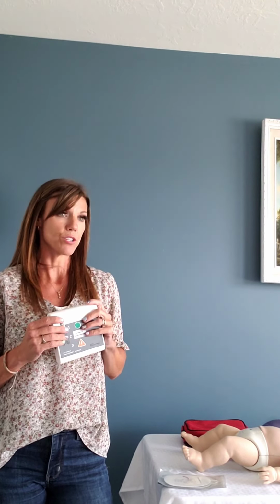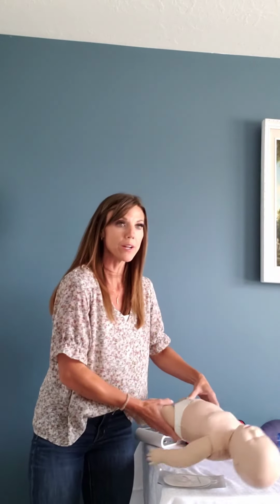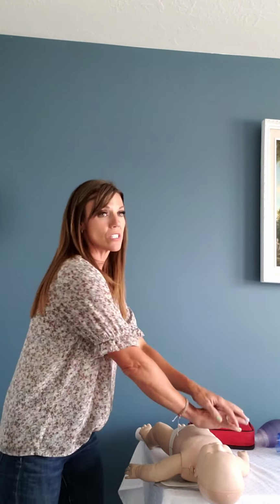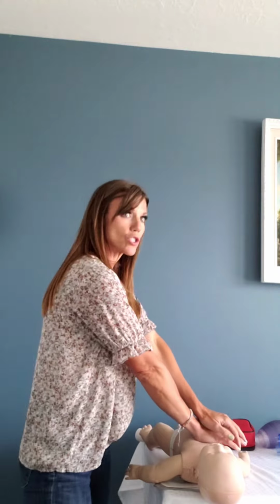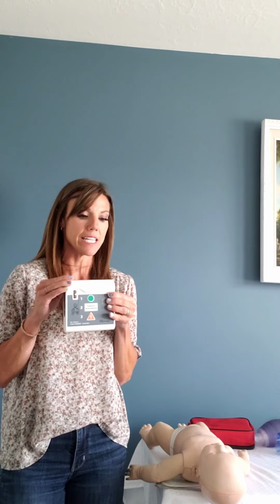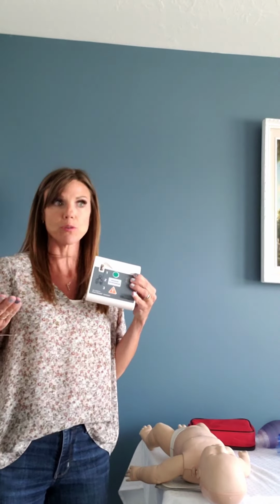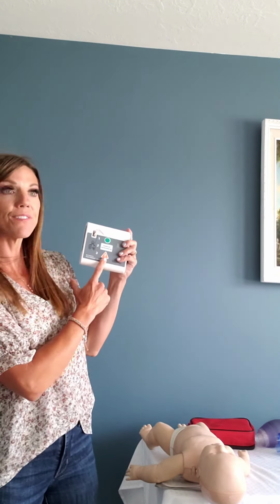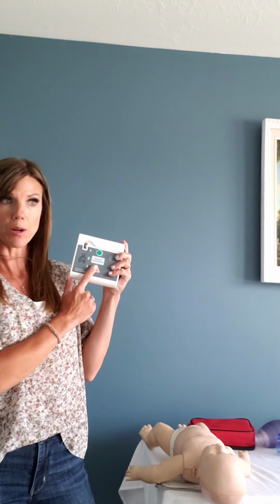So when you see that ventricular fibrillation, we need to right away start our chest compressions. Start compressing, circulating that blood and oxygen to keep things alive. Whenever we're not doing CPR, their survival rate, the chance of them surviving, drops and drops and drops. So it is important, as soon as we can, to start chest compressions, send somebody to get the AED, and as soon as we get the AED, let's turn it on and it will walk us through. It tells us everything to do. So turn it on, follow the promptings. If it says it's a shockable rhythm, press the shock button.